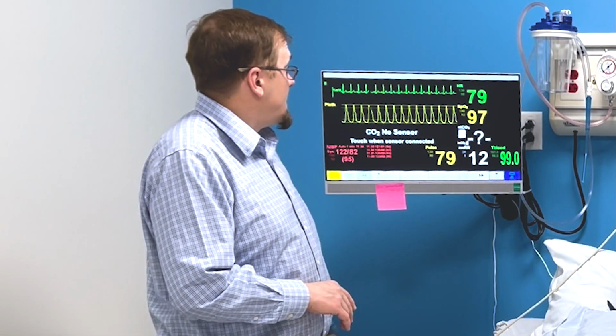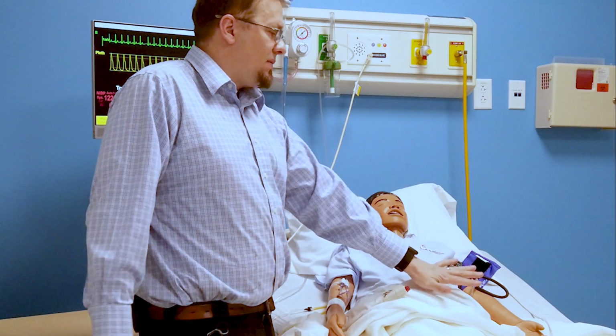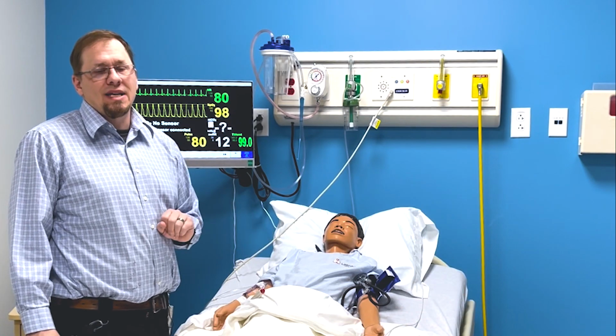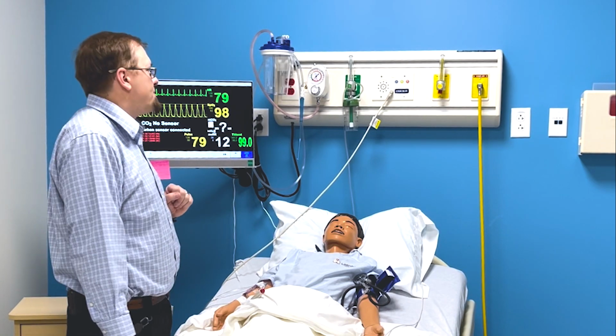So go over mostly all of the patient monitor, ask if they have questions. Asking questions is important because until you really get your orientation down, or even when you do, you're going to forget things. I forget about belly sounds all the time. People will be like, well, what about bowel sounds? And then I talk about my bowel sounds, or I'll talk about different things that I've forgotten. So make sure it's a two-way conversation and you're getting feedback from them.